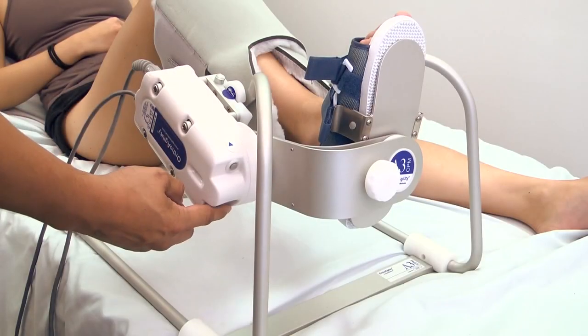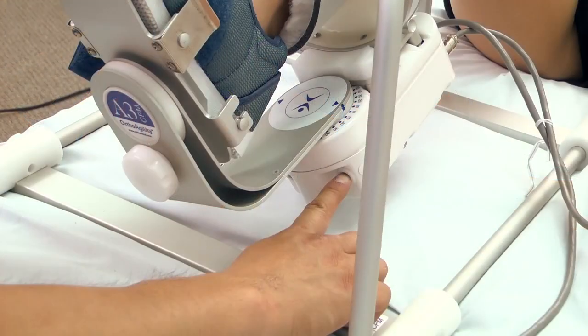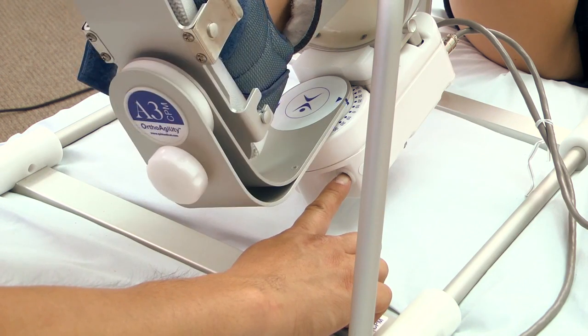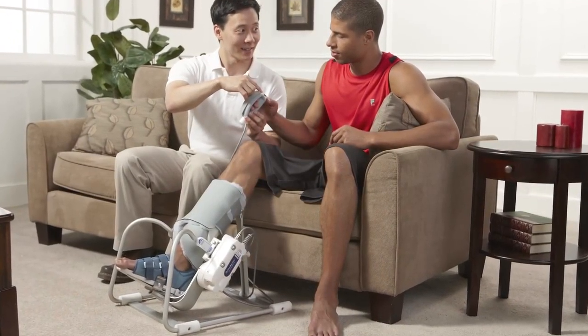The OrthoAgility A3 Ankle CPM offers three directions of motion: plantar flexion and dorsiflexion, inversion and eversion, or a combination of both. The A3 can be adjusted for bed or in-chair use, making it ideal for home or hospital settings.